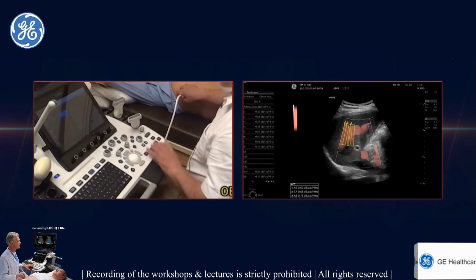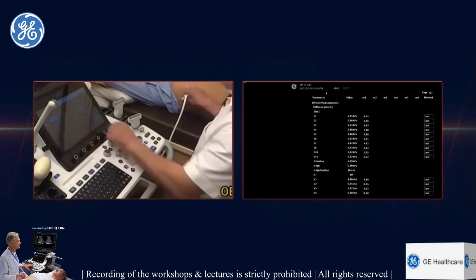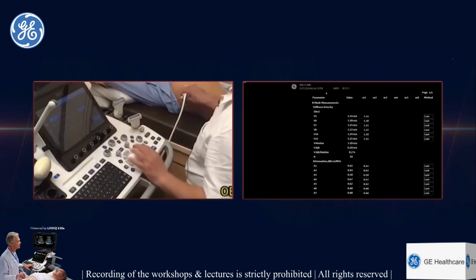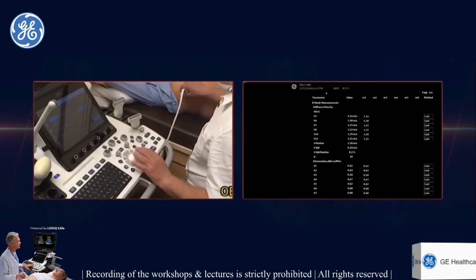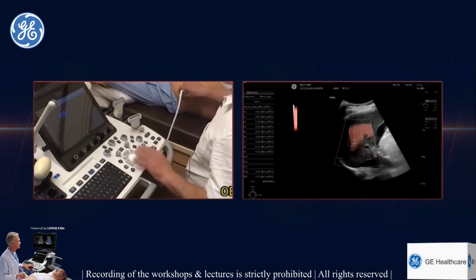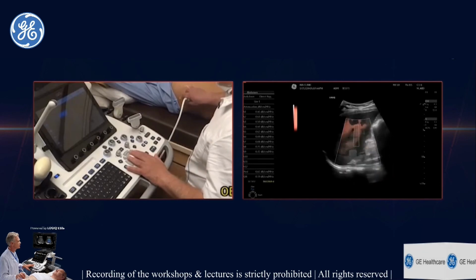And we get an average value of about, values are in decibels per centimeter per megahertz. Now here again we are getting some extreme values, so we'll take a couple more values because I think we didn't get a very good map here.